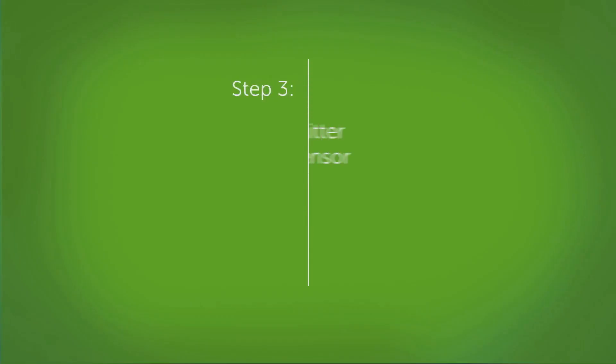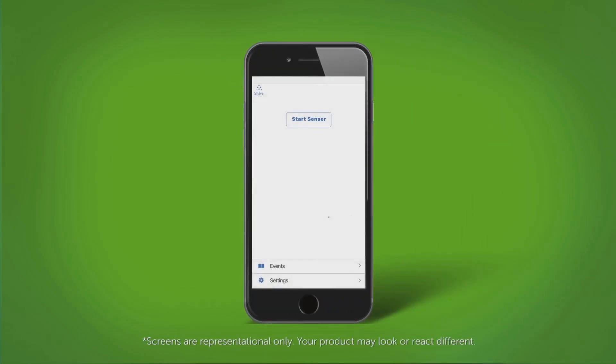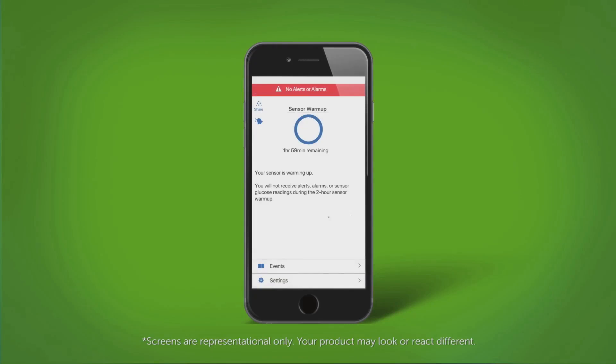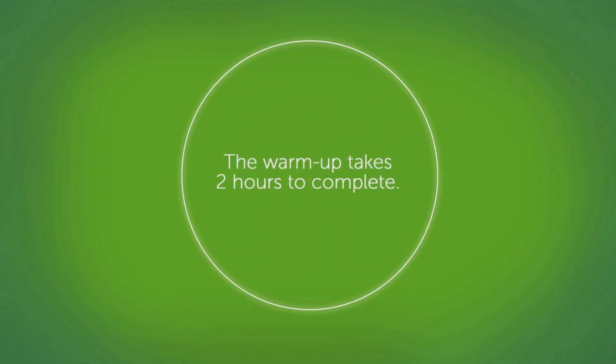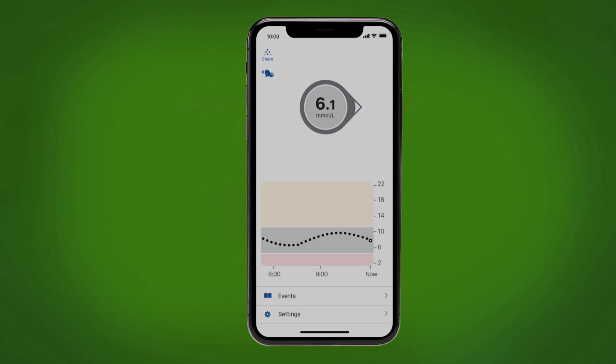Now it is time to pair your transmitter and start your sensor. Wait for your transmitter to pair, then tap the start sensor button. Now your sensor warmup has begun. The warmup will take two hours to complete. You will not receive alerts or readings during this two-hour sensor warmup. After your two-hour warmup, you get your first sensor glucose reading.